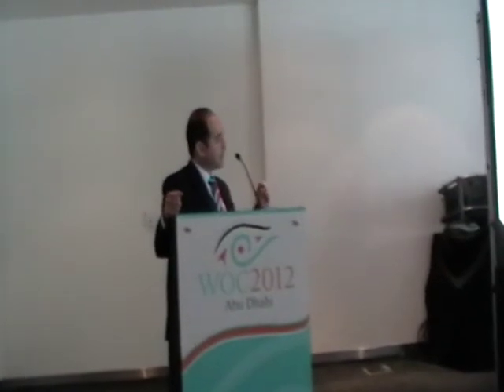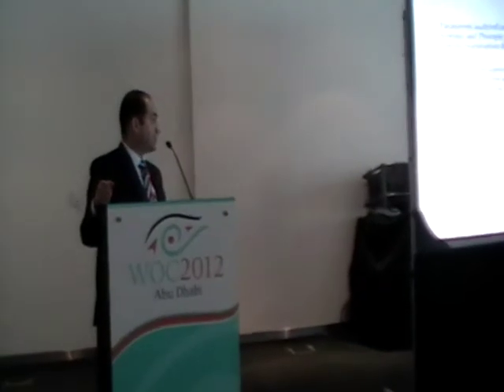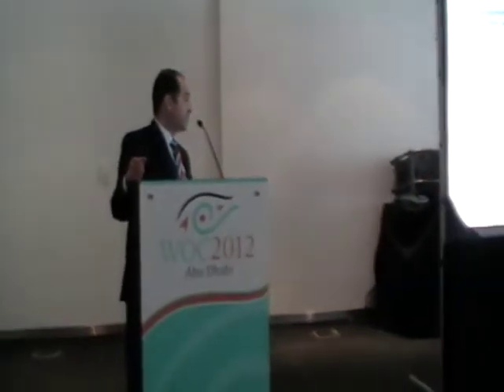With that intraoperative corneal map, they are selecting the geometrical center and marking it, and intraoperatively, especially if they are doing the surgery under local anesthesia injection or general anesthesia, they are centering the optical zone to the geometrical center. That's one of the ways. Definitely it will solve the problem for local anesthesia injection and general anesthesia.